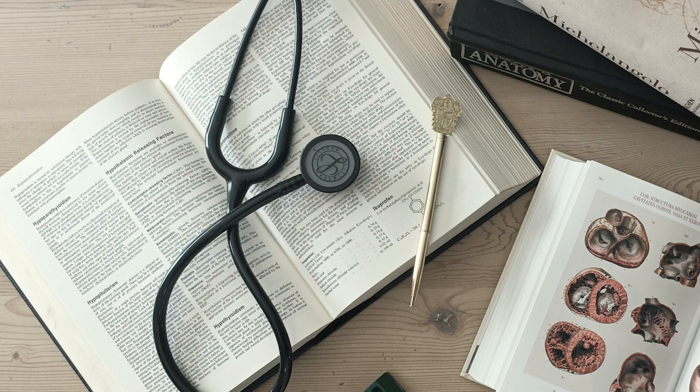Got it. So if we're looking at an ECG, how do these flutter and fibrillation patterns visually distinguish themselves? What are the key ECG hallmarks? On an ECG, the distinction becomes quite clear, usually immediately obvious once you know what to look for. For atrial flutter, you'll see multiple regular, very fast, small waves. These are your P waves, but they often look different, like a classic sawtooth pattern, particularly in leads II, III, and aVF. The key is their regularity and rapid atrial rate.